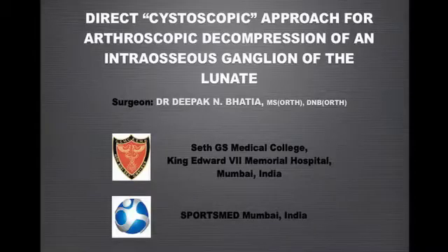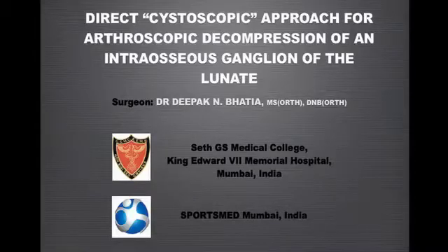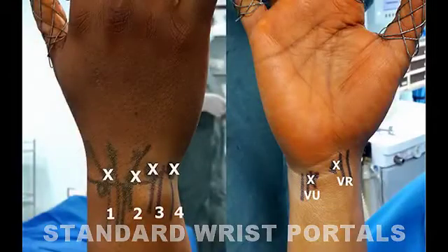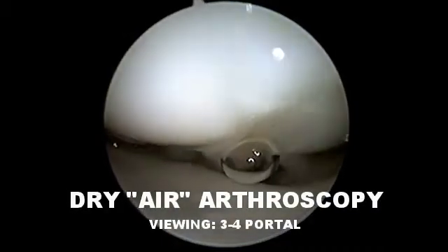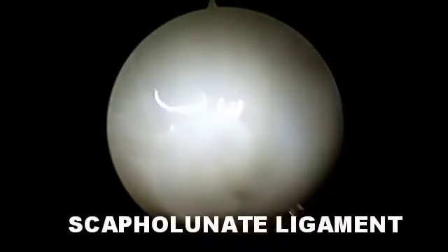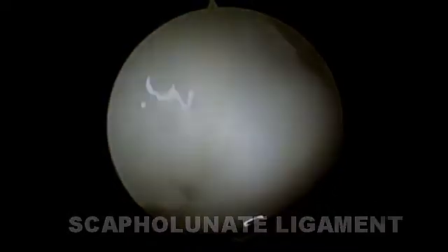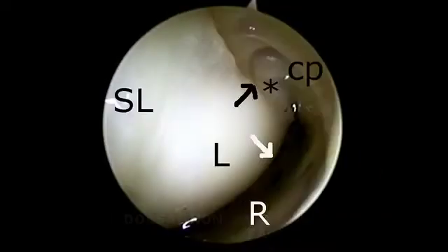Direct cystoscopic approach for arthroscopic decompression of an intraosseous ganglion of the lunate. Standard wrist arthroscopy portals are marked and a diagnostic arthroscopy is performed using the 3-4 portal. Dry arthroscopy is then performed to visualize the non-articular lunate surface.